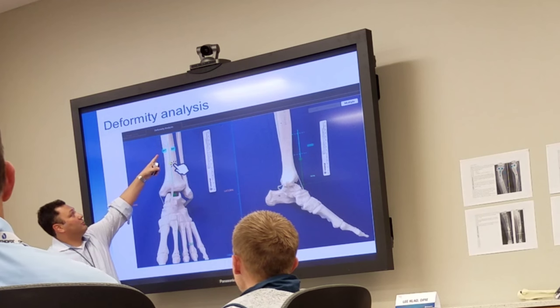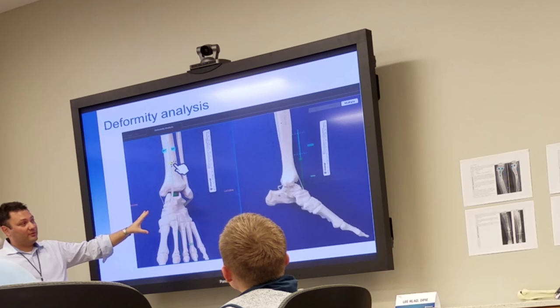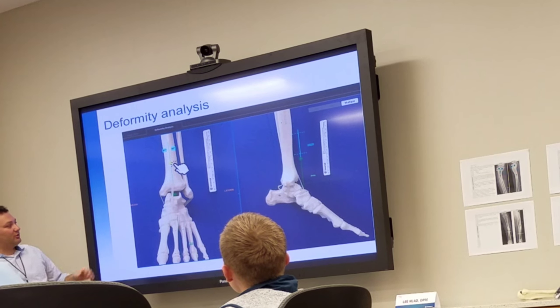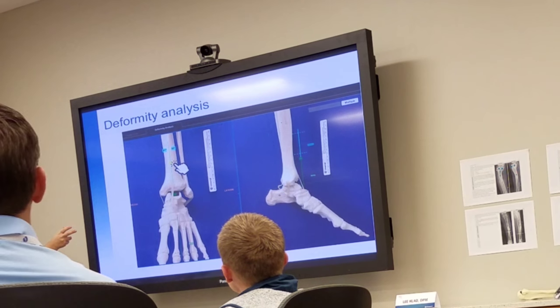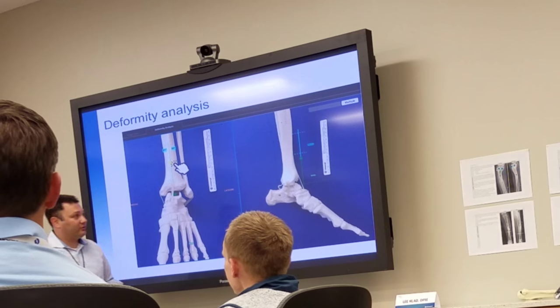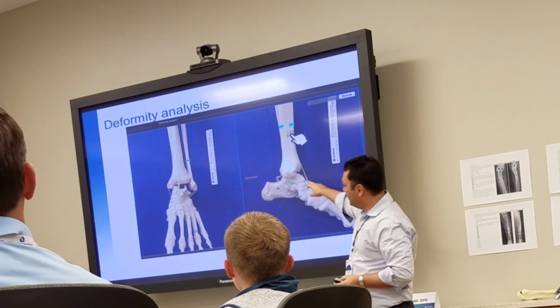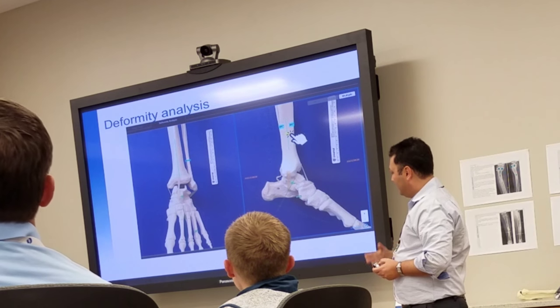Make sure the lines are in the same spot. Here's your AP — this is a little bit different because now we're dealing with the foot. The computer is looking at the tibia versus the foot as one long unit, trying to make sure that unit is aligned. Make sure the foot kind of lines up with the leg — no translation or varus/valgus — so you can get this simple portion done. On the lateral side, you have these two separate portions, and this is where it's much easier for the surgeon because they're forced to make this line and recognize that apex anterior much easier.